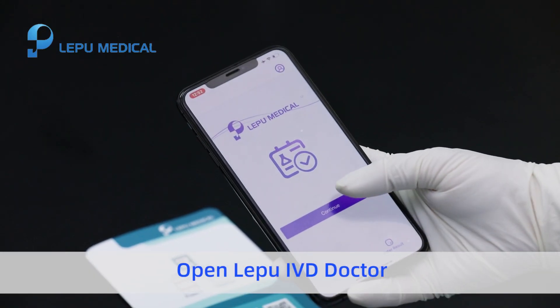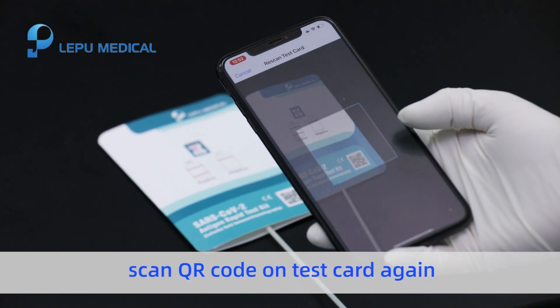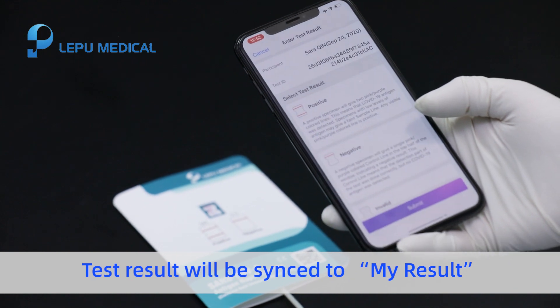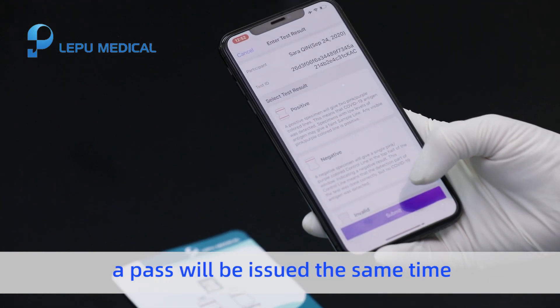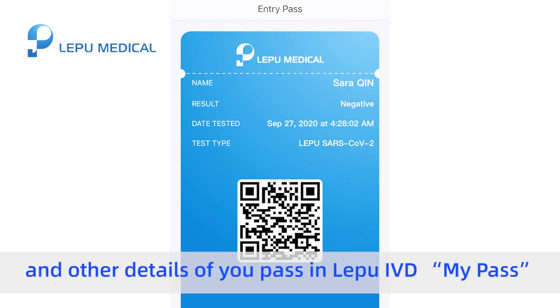Open Lepu IVD Doctor and tap 'Enter Result'. Scan the QR code on the test card again, select the corresponding result, and submit. The test result will be synced to 'My Result'. A pass will be issued at the same time if the test result is negative. Check the expiration date and other details of your pass in Lepu IVD 'My Pass'.